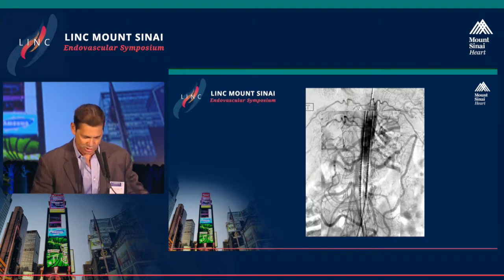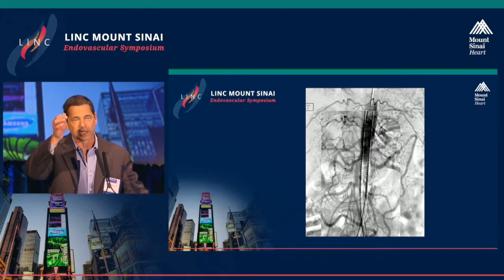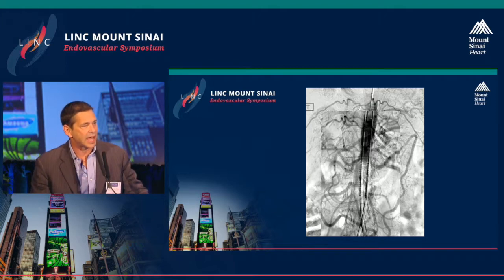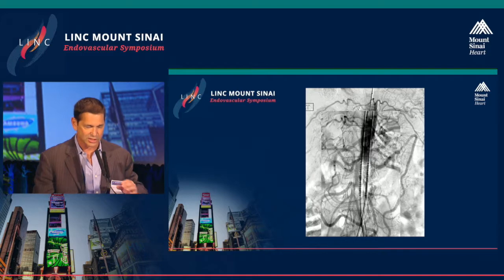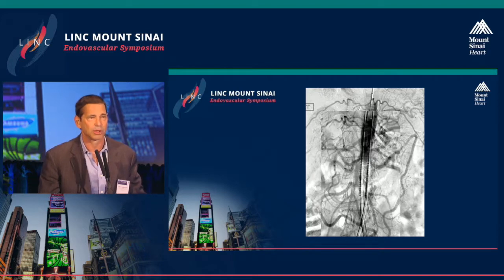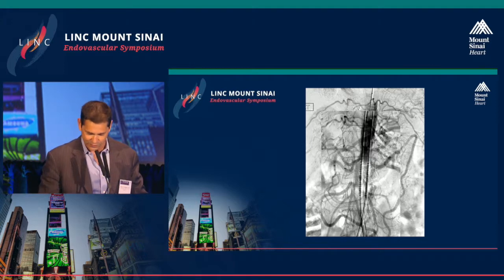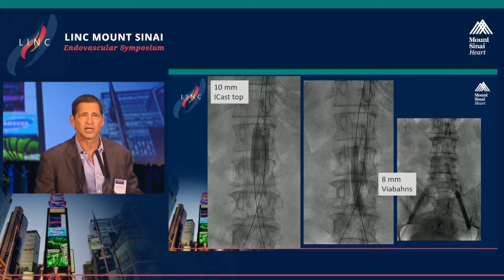These are balloon expandable stents positioned right below the renal ostia. One trick I like here — if there's a sense that there might be some acuity — is to take a 12- or 14-millimeter balloon above that occlusion and gently inflate it and tug it down a little bit. The rationale is to create a little bit of space where you think there might be thrombus at or near the renal arteries. We start with balloon expandable stents for the precise positioning and anchoring support at the top. These are iCAST stents placed up top — two 10-millimeter iCASTs, 20-millimeter diameter.